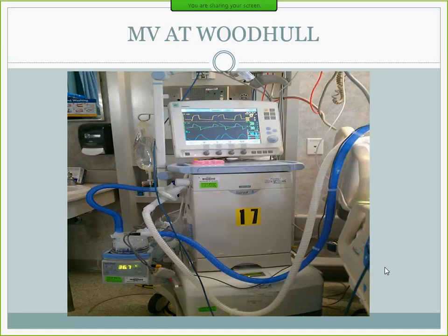It looks something like this. So this is your inspiratory limb. It pushes air into the patient. Through the white limb, it is an expiratory limb. It goes back into the machine, and it's a closed system. Whatever goes in comes out.